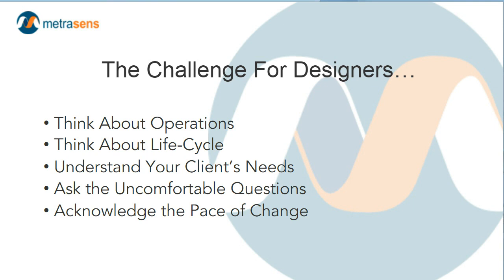Think about life cycle. MRI equipment today has an average lifespan of probably somewhere around 8 to 10 years. And that device will be pulled out and another device will be put in. If we design the physical facilities to the minimum standards of the first piece of equipment, that means that whatever we did that was smart, hopefully most of it, will be torn out to facilitate the next scanner if it requires a room that's 2 feet wider, 2 feet longer, different shielding requirements. So think about the overall lifespan of the physical facility and build in the equipment and operational flexibility.